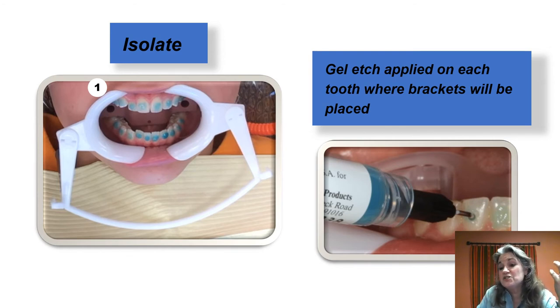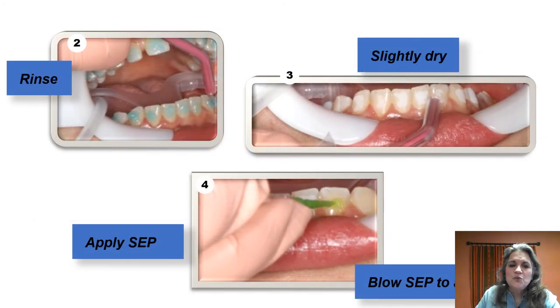We like to etch both the maxillary and mandibular arch at the same time, placing the gel just where the bracket is going to be positioned — following the same technique as direct bonding. If you etched for 10 to 15 seconds direct, that's exactly what you'll do here. Then we rinse, lightly dry, and apply self-etching primer to the conditioned surfaces. Make sure you blow it nice and thin, and make sure you're not getting too much self-etching primer interproximally.